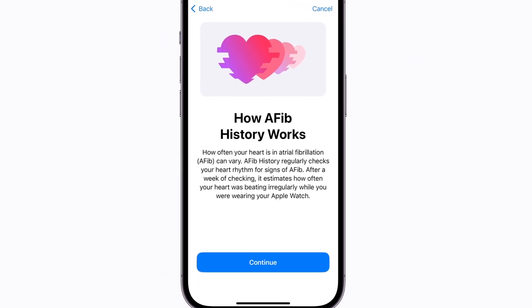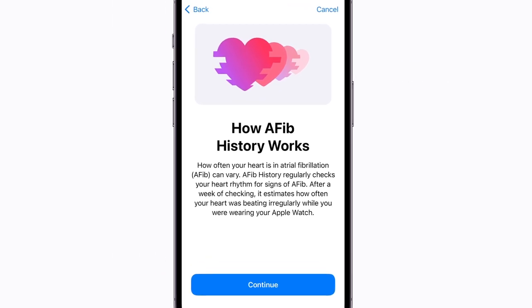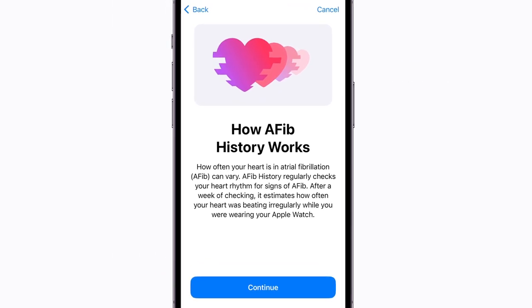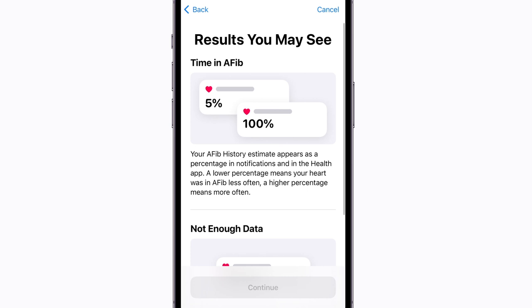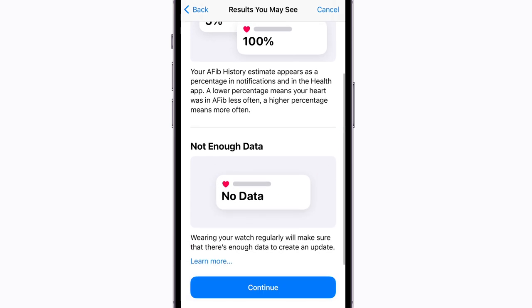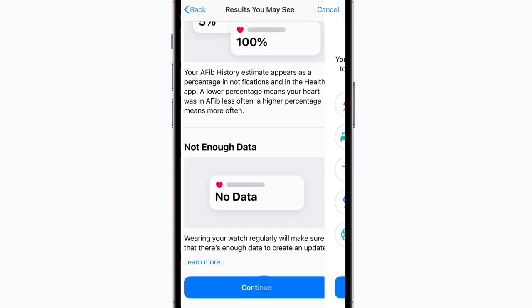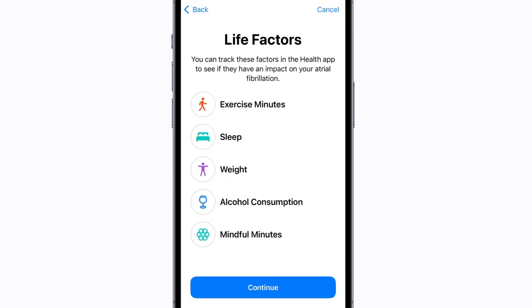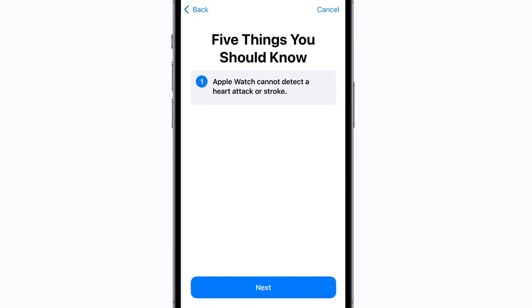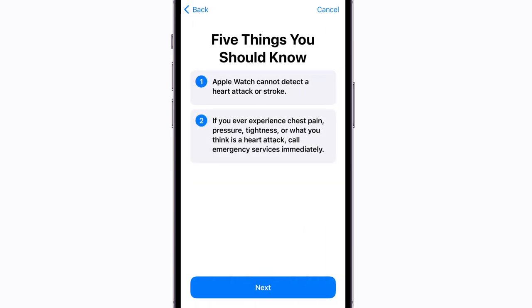On the next few screens, you'll read more about how AFib History works, the results you may see, other life factors you can track to see if they might affect your AFib, and five things you should know about AFib History tracking.